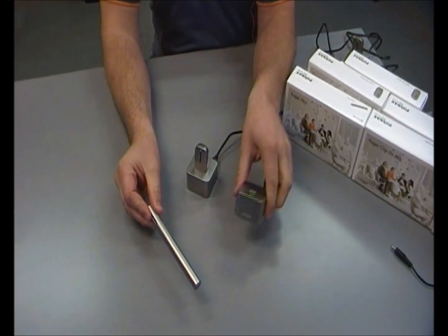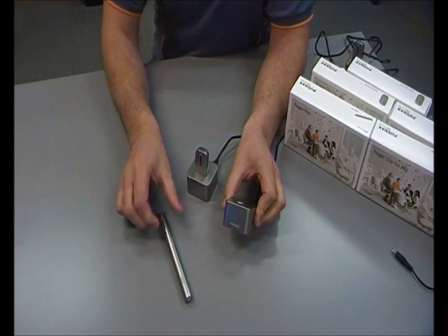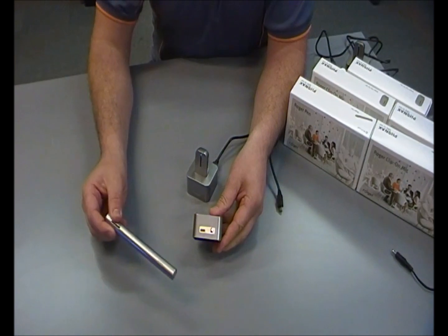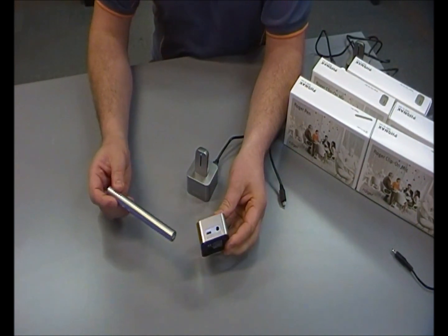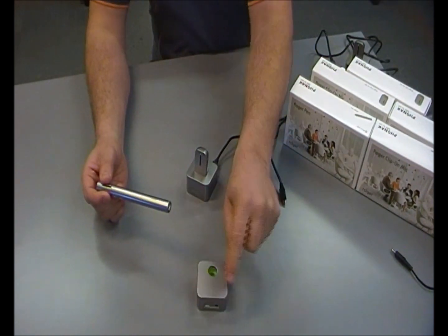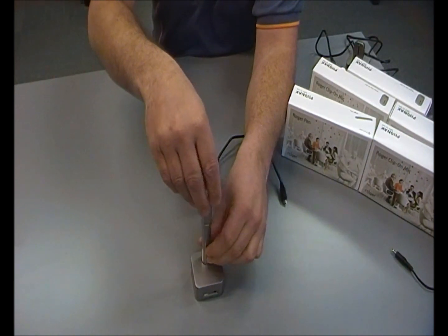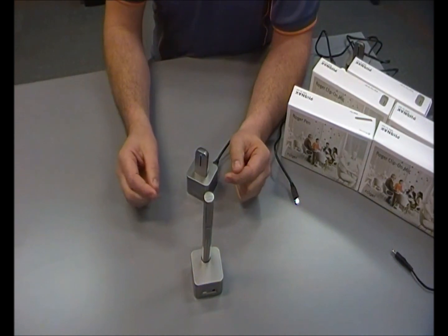The Roger pen comes with a docking station which also charges the unit when it's not in use. On the back of it, it actually has an audio input for connection to external audio sources. This means I can use my Roger pen and FM system with the television or any other audio source simply by placing the docking station beside the audio player or TV. Placing the pen in the docking station, I can now hear whatever I've connected to the docking station.